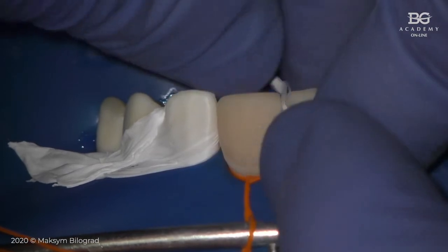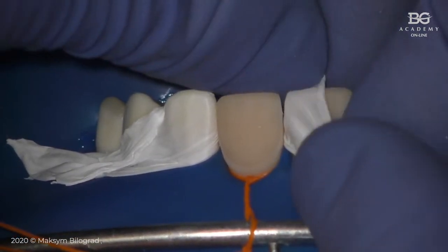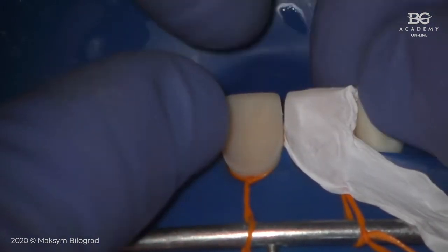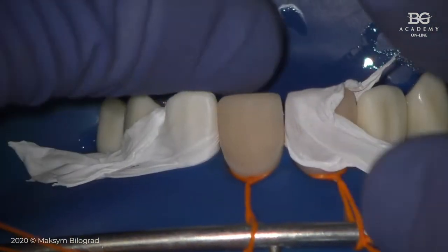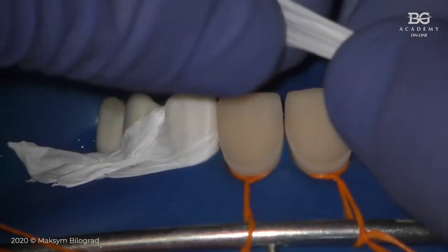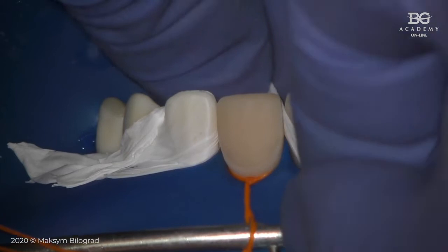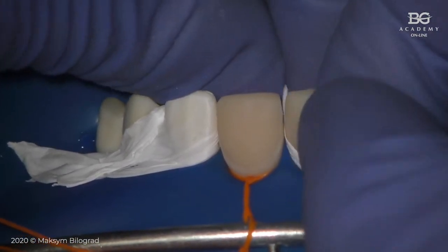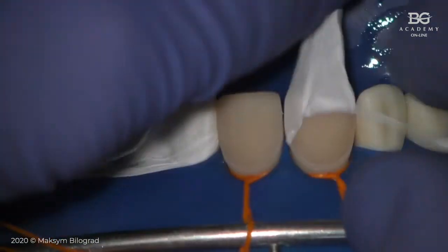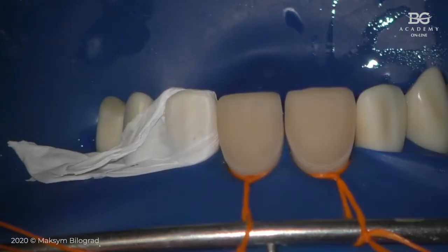Or instead of Teflon, what you can use? Instead of Teflon, you can use metal band. But Teflon is thinner, so there will be no problem with interproximal area. Okay, so we just put Teflon in between. This one is bad.